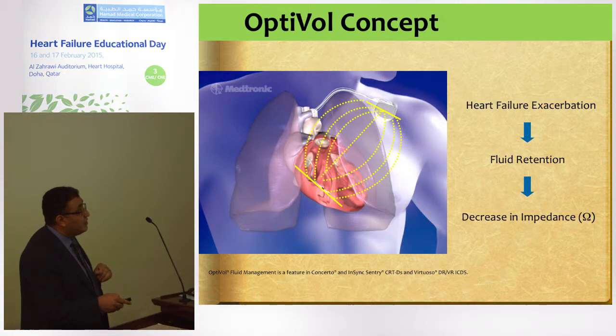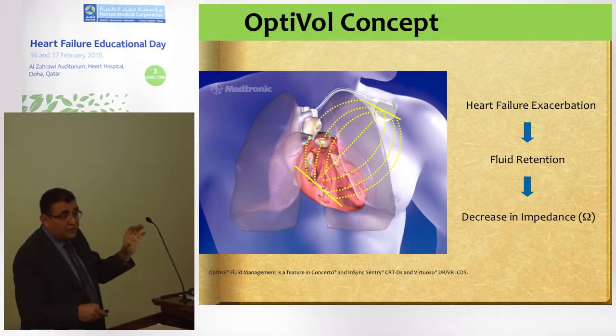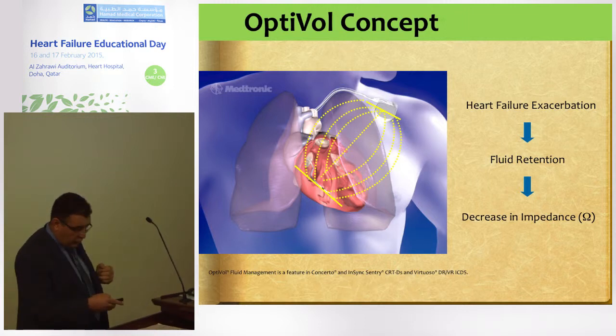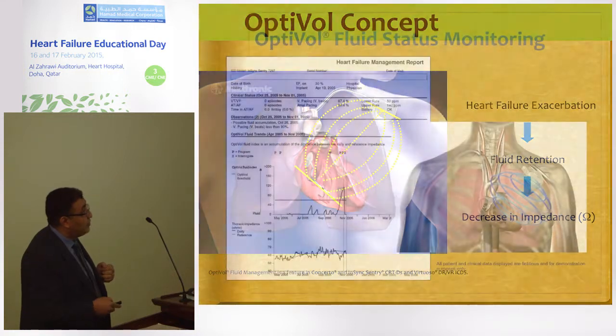Once the patient is having heart failure, there is more fluid retention, and there will be a decrease in impedance, and the device has a sensor and is able to detect that, and it will send an alarm. It will beep to the patient, and if he has home monitoring, it will send it to our station here.